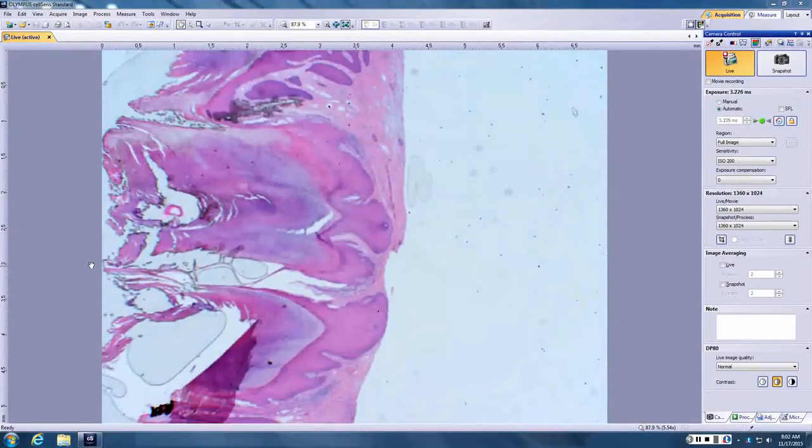Alright, so for this you have a bit of a cup-shaped invagination with the hyperkeratosis. There's central hypergranulosis as well. Yep. So we could be cutting into the edge of a KA. That would be the concern, the possibility that you're cutting into the edge of a keratoacanthoma. Or what else would be the other most likely? It could also be a wart, because we're on plantar skin.